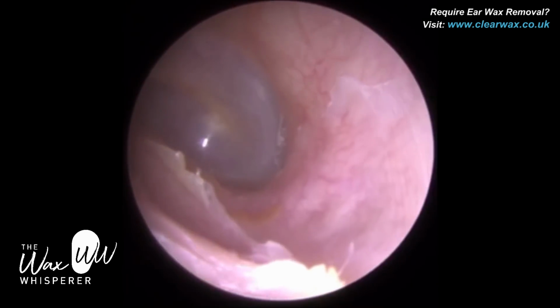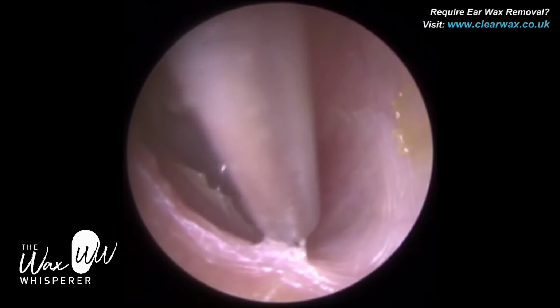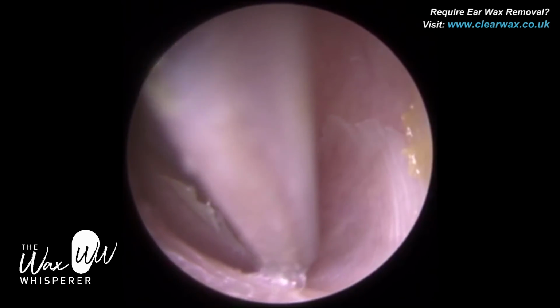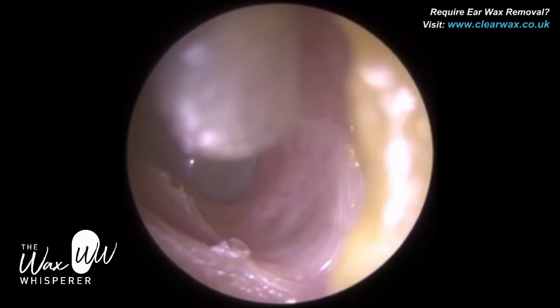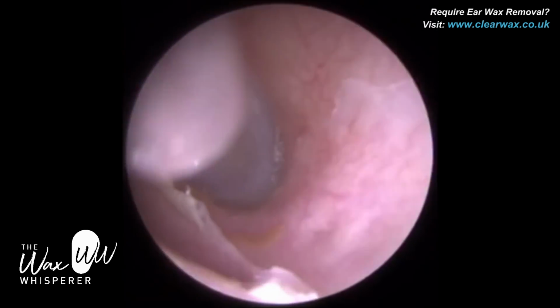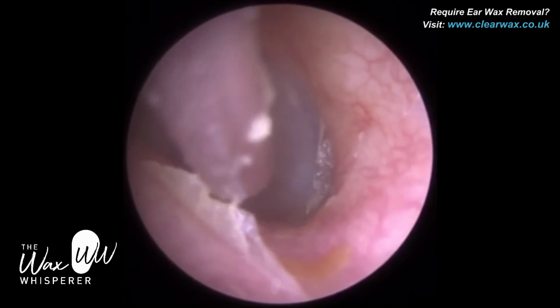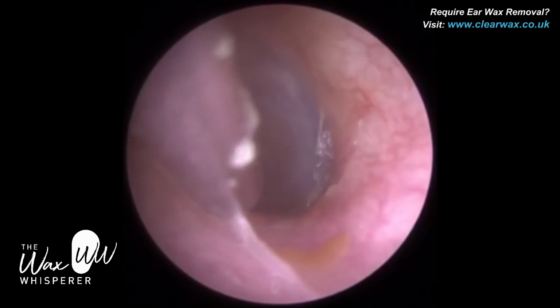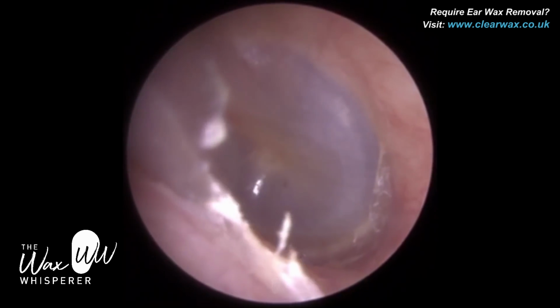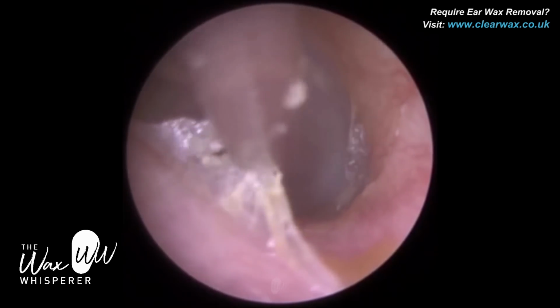So nearly done. As I said, there's a bit of keratin just at the entrance here, and a bit more medially. I can't remember if I managed to get that piece of skin a bit more medial. I think I might have left that. We'll see in a moment. Oh, I'm going back for it. I'm pretty sure I don't get all of it because it is very stubborn and very tightly adhered. But I'm happy with what I've done. I've removed as much dead skin keratin as safely as possible.